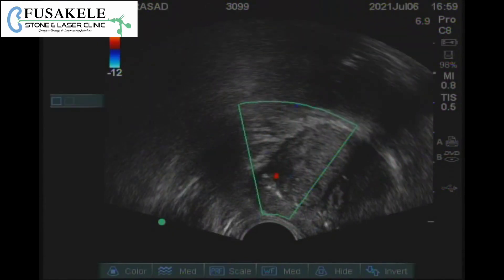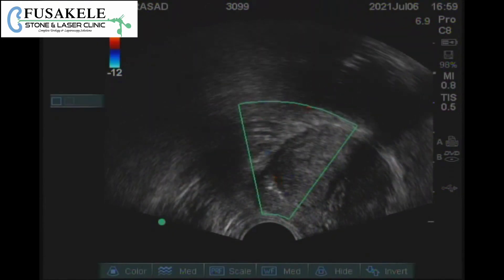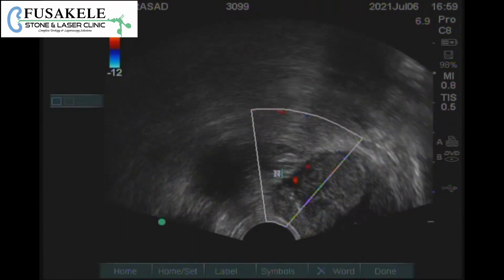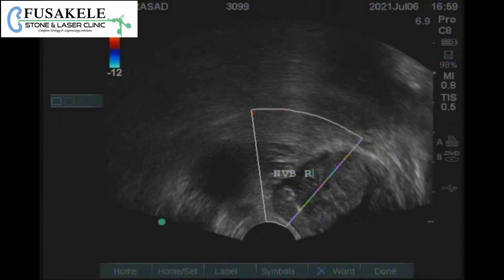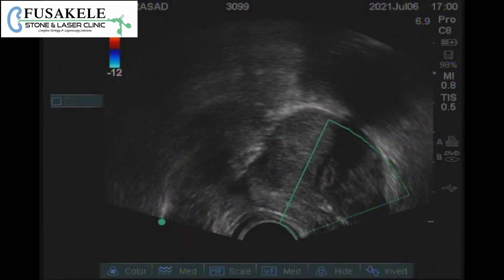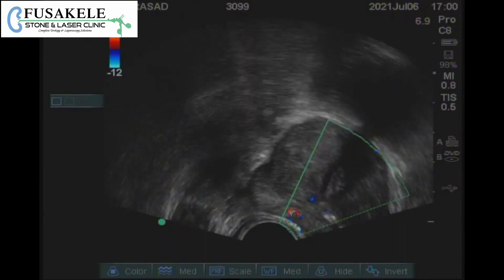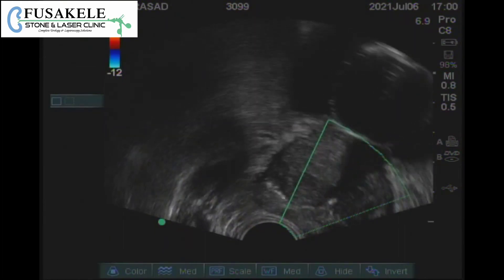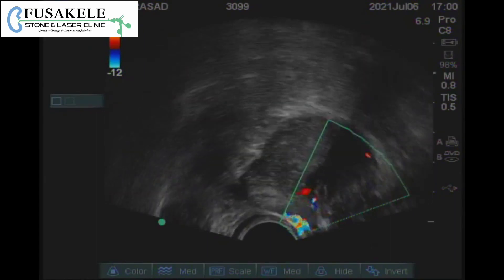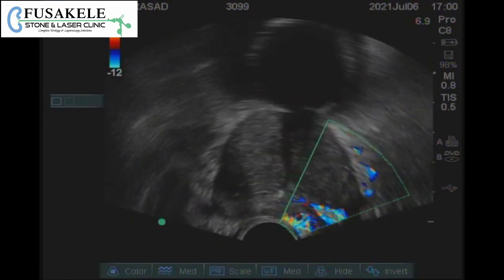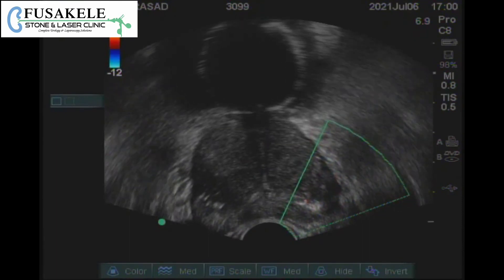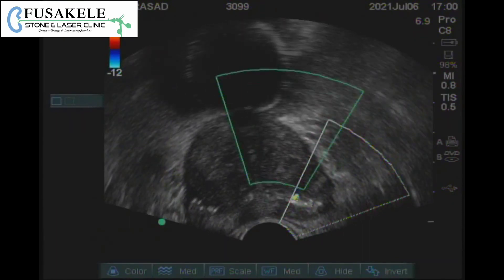Now we are further examining with the help of Doppler. This is the right side neurovascular bundle. We can also use Doppler for looking for any lesion which is vascular in nature. This is a very good demonstration of the peripheral zone and the central zone, which we can make out clearly.